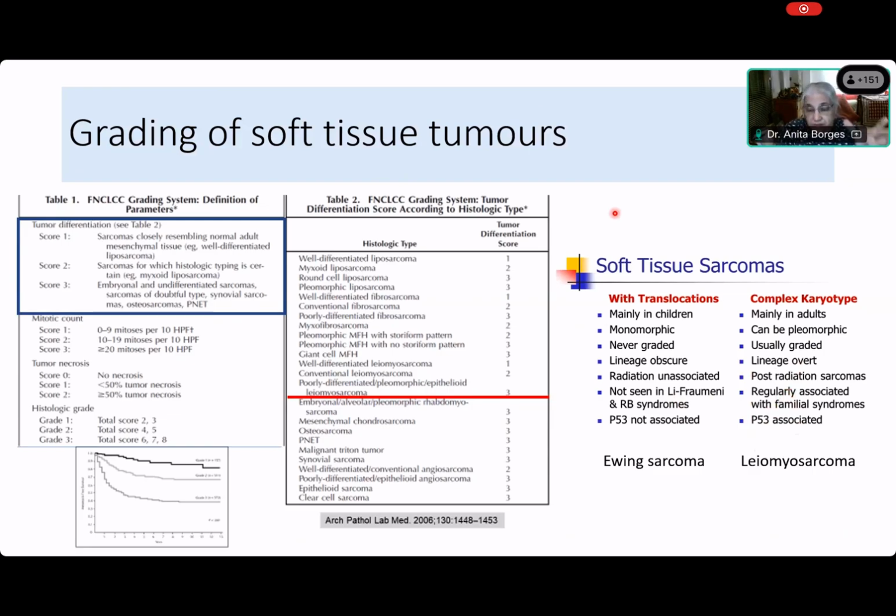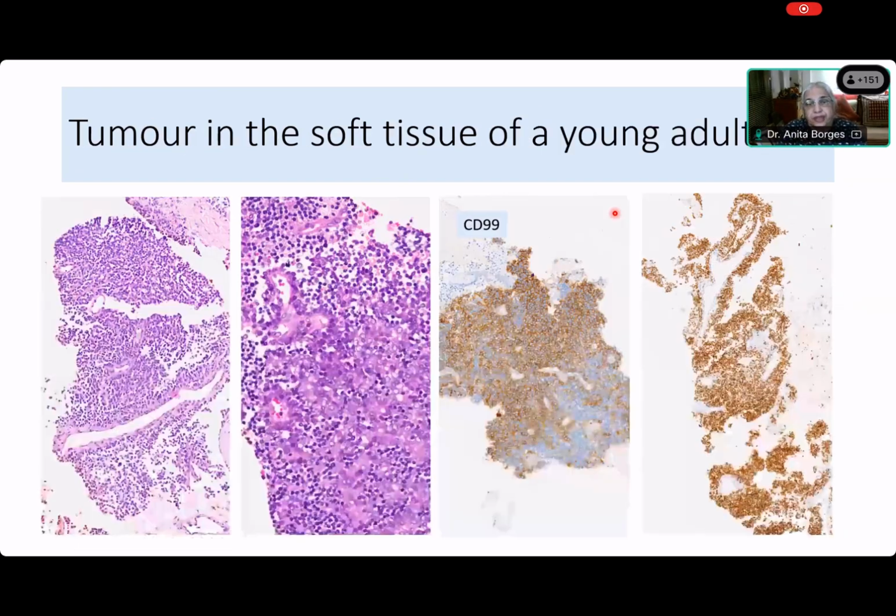So I just thought I would tell you this because this is relevant to the topic that I'm taking. And this should not be a difficult thing. It's just put up because I want to know what is the fourth picture. It's an immunohistochemistry. All right, Navneet, are you there? Yes, ma'am. All right, quick, Navneet. This is a what kind of tumor? Where does it fit in our patterns? Some poorly differentiated. Yes, but what's the pattern? Round cell. So it's monomorphic and it's round cell. Yes. Now, is it monomorphic and round cell, Navneet?